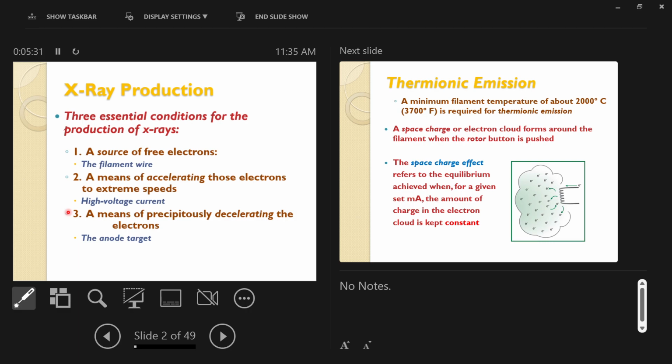A car hitting a wall at 6 miles an hour crumples the bumper a little bit, maybe, might make some sound, right? A car hitting a wall at 60 miles an hour crumples a lot more metal, makes a lot more sound, hurts people, damages the wall, right? More energy is deposited into the wall when the car is moving fast at the wall versus when the car is moving slowly towards the wall.